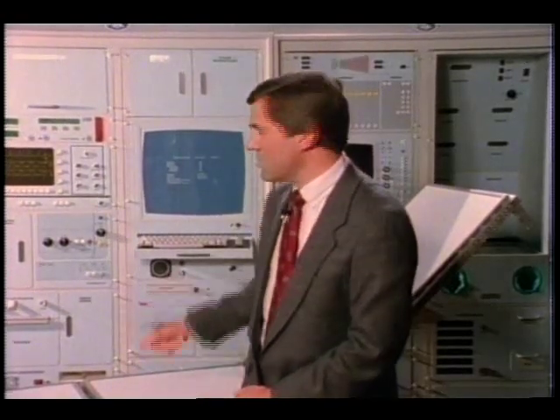One of the things that we're developing at Johnson Space Center is a concept known as the Medical Information Bus, or MIB. The MIB would enable all the medical devices on the health maintenance facility to not only interact with each other, but also interact with the HMF computer. Additional things that would be housed in the health maintenance facility computer would be things like diagnostic and treatment protocols, or inventory management for the HMF. Another aspect would be the crew performance data, especially as it related to the exercise devices.